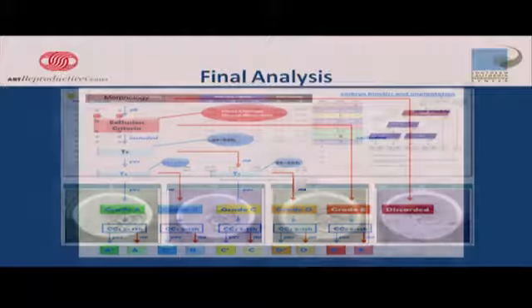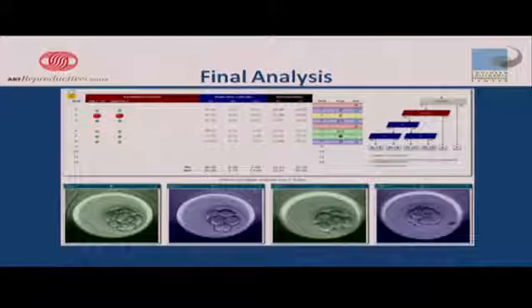And those things absolutely correlated with the implantation potential in babies being produced in randomized trials and in non-randomized trials all over Europe where they were doing this initially. And in fact, there was a more recent paper out of the English group that definitely showed that they had success with this, increasing pregnancy rates more than 20% because of using this technology.